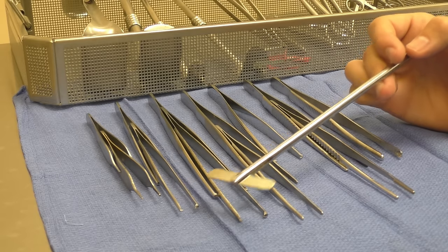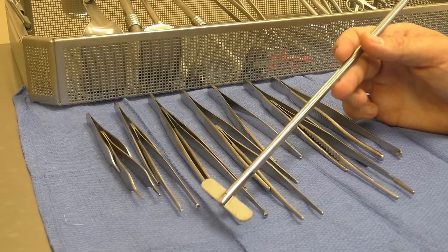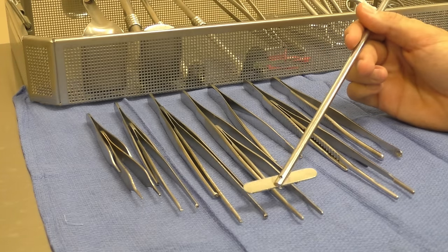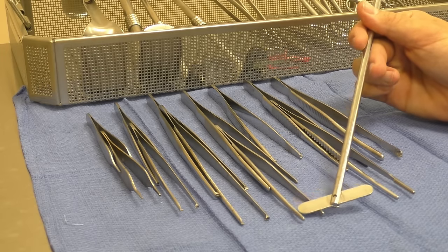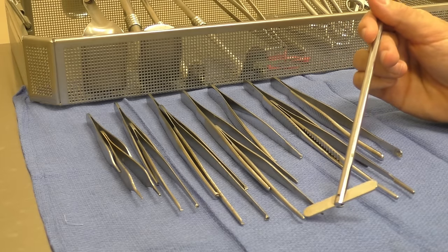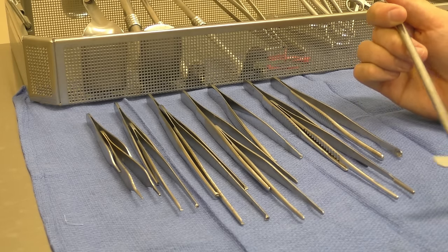These could be used for subcutaneous. They're also known as the rat tooth. A lot of surgeons will just say, hey, you know, give me a rat tooth forceps. This is what they're asking for. And we have a deeper version for them as well. These are similar in their physical nature to the rat tooth, but they just do not have the teeth at the end of the forceps themselves.